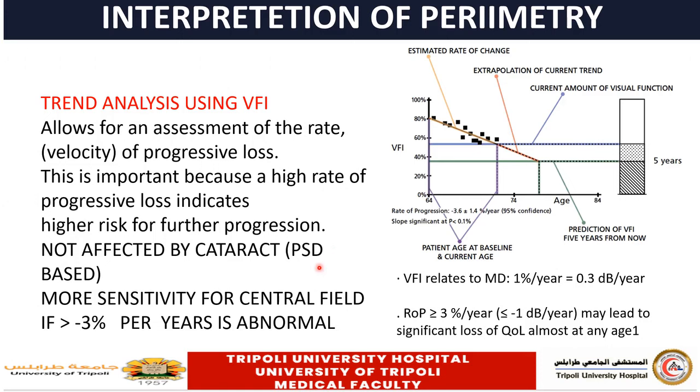However, if the mean deviation of the patient drops markedly below minus 20 decibel, in this situation, as I said before, the pattern standard deviation will not be formed, and at that time the visual field index will extract its information from the total deviation, and it becomes less reliable.